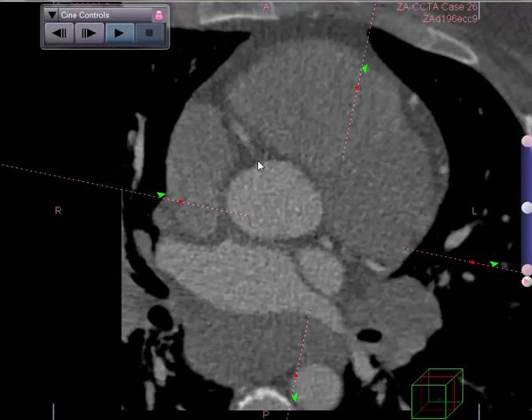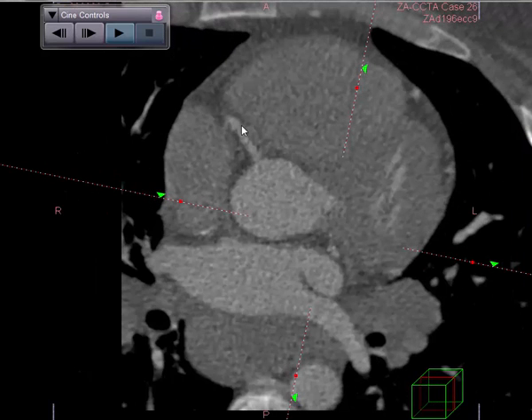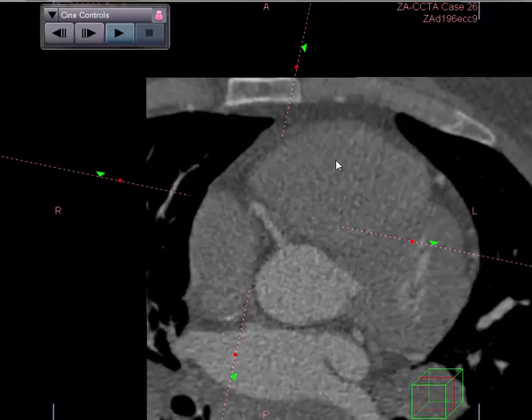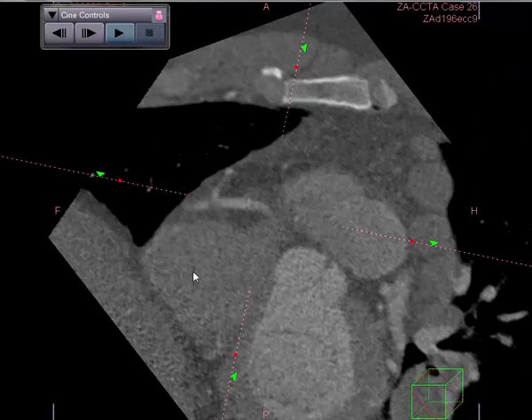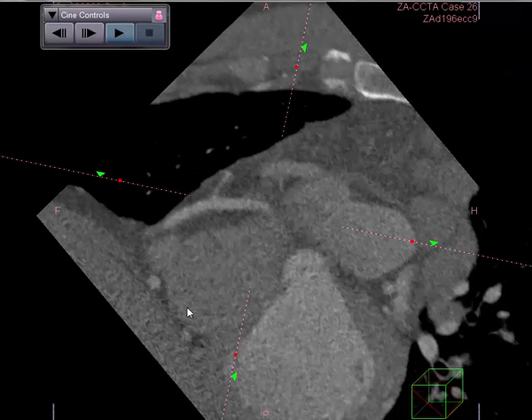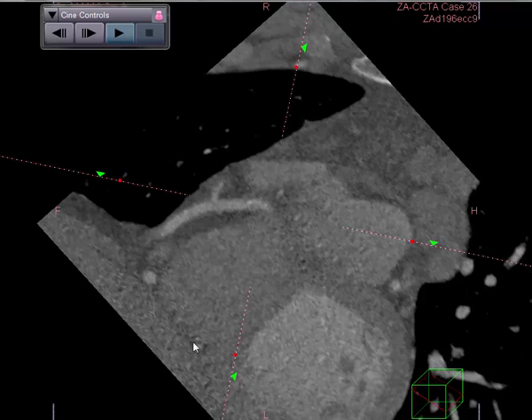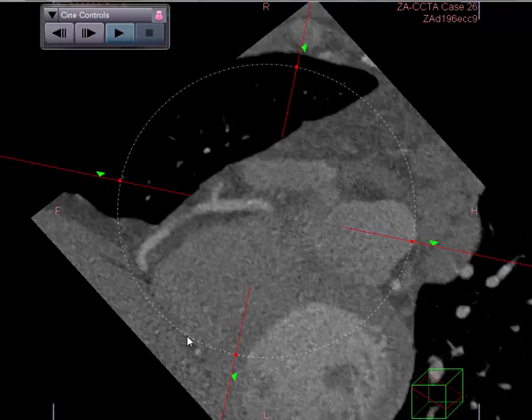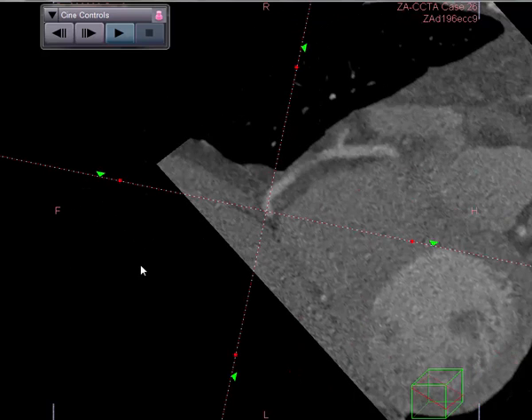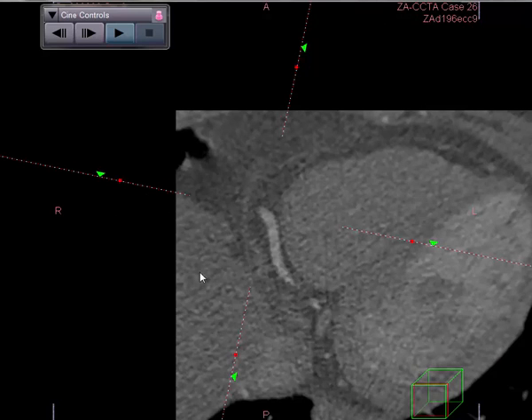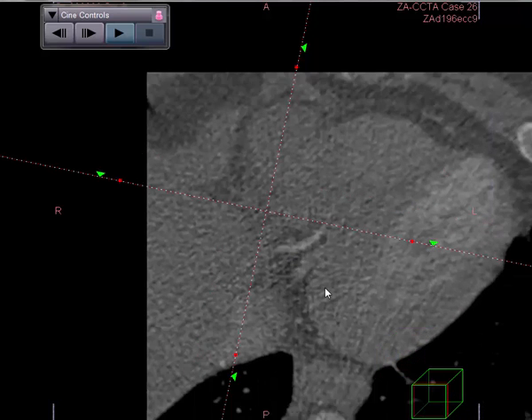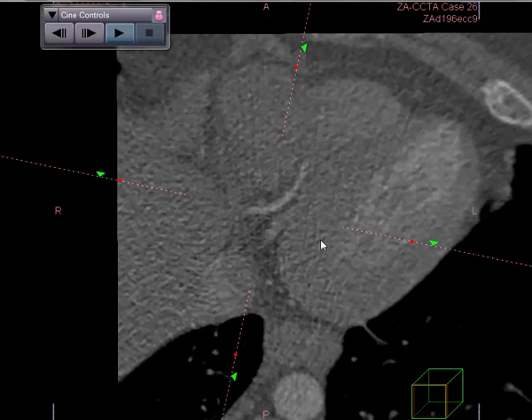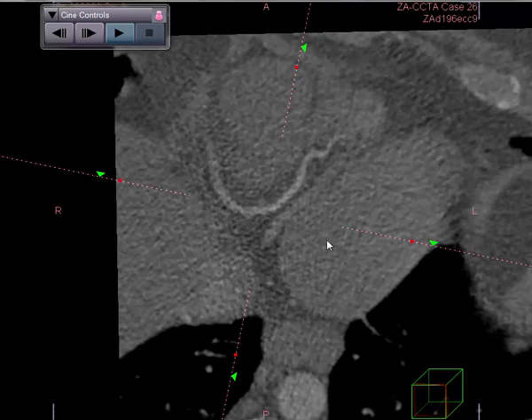Let's look at the right coronary. It's difficult to evaluate, but you can follow the right coronary all the way down. The proximal segment is normal. We proceed to the distal segment going to the foot view. This appears to be normal, and there is also a small but normal posterior descending.